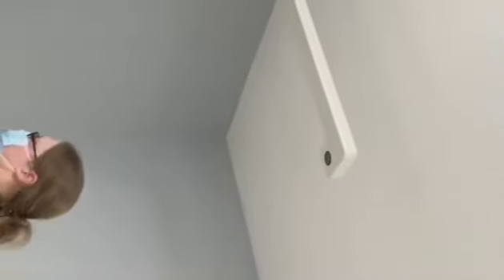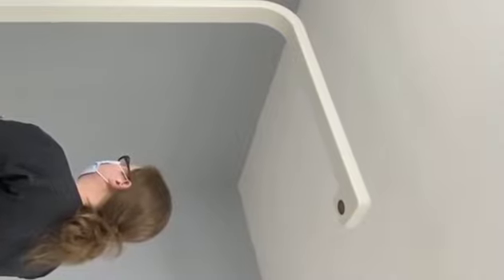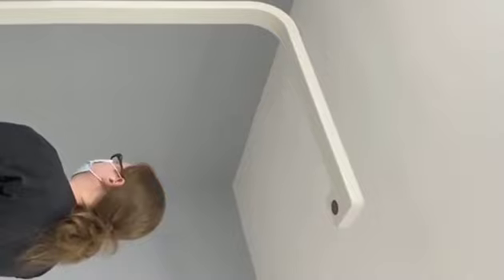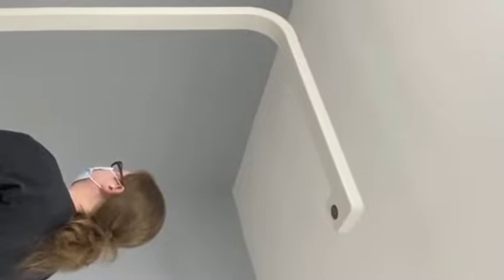Start measuring height and weight. Please stand straight and look straight ahead. Height and weight measurement completed.